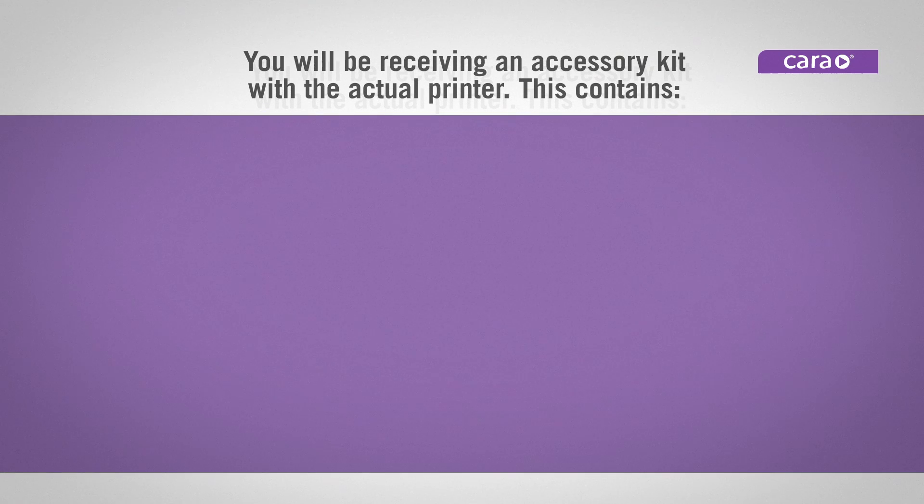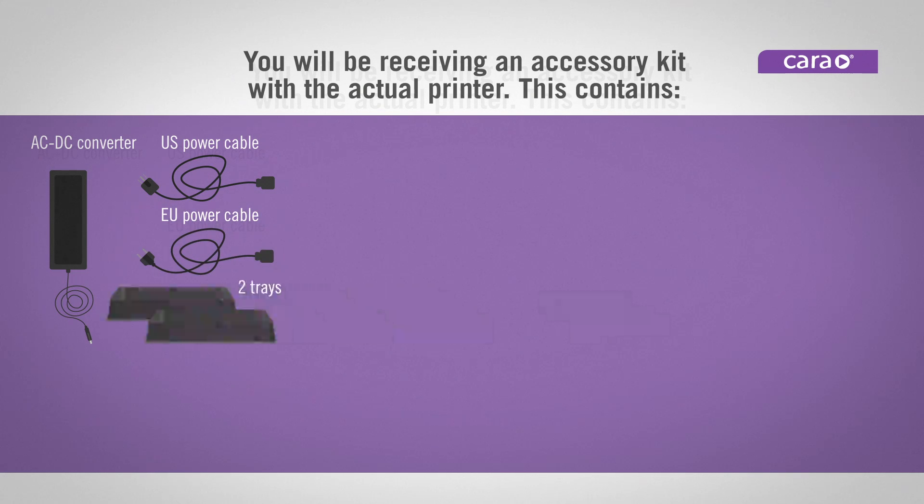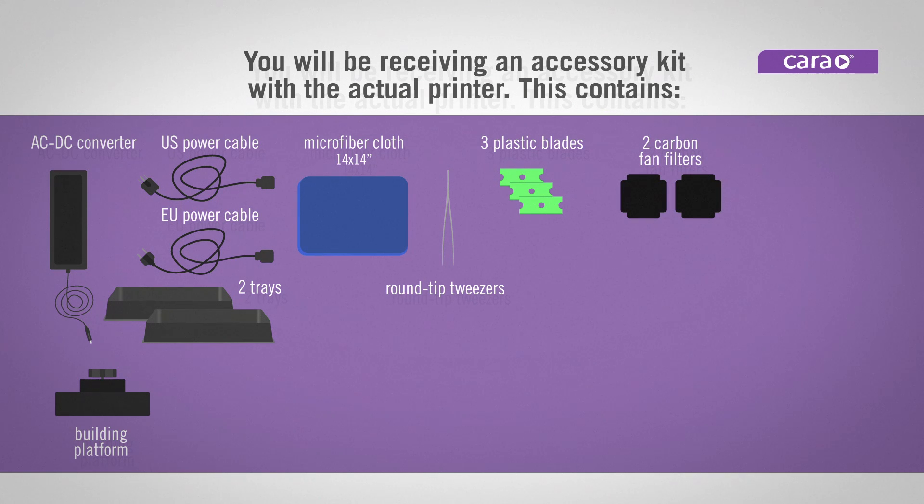Your order includes one AC/DC converter, one US power cable, one EU power cable, two trays, one building platform, one microfiber cloth, one pair of round tip tweezers, and three plastic blades.